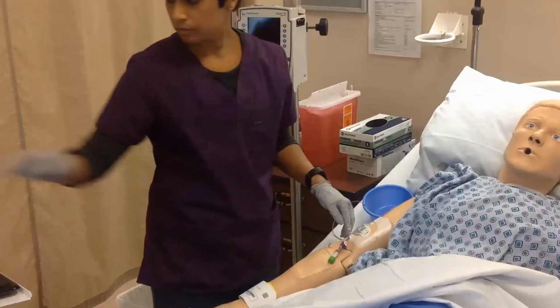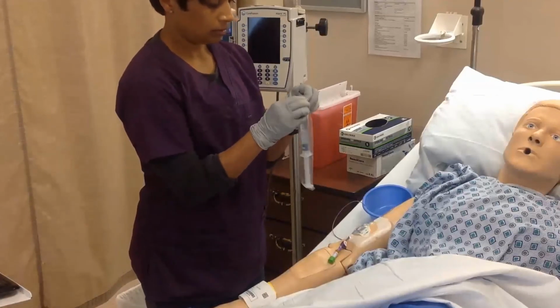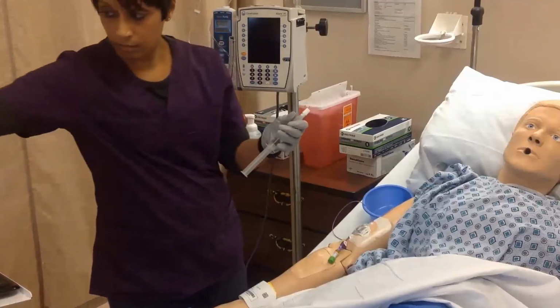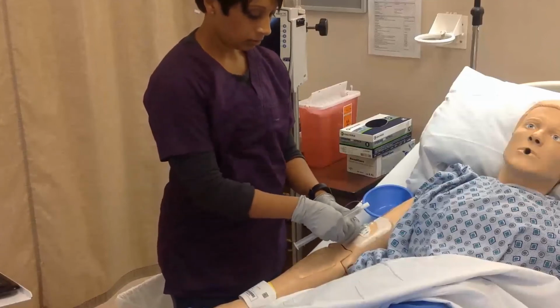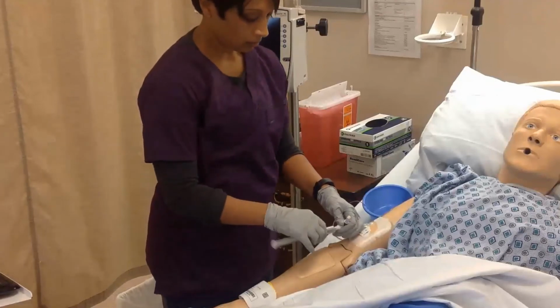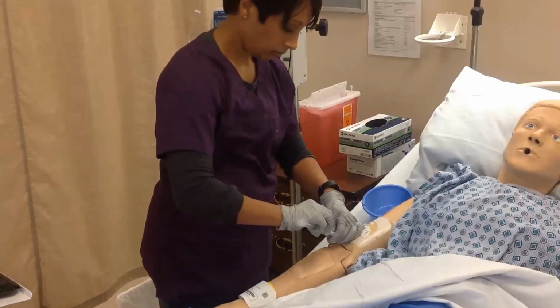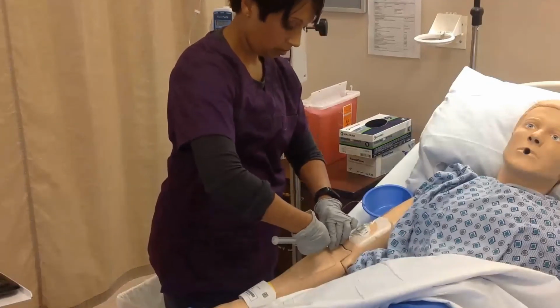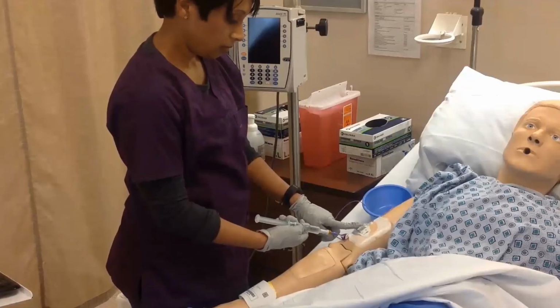Next, remove the normal saline flush from the packaging and hold in your hand. Vigorously wipe the end of the PICC line port you are about to access with an alcohol wipe for 15 seconds and allow to dry. If there is a green Curos cap on the port, remove and discard. The port does not need to be wiped again with alcohol. Be careful not to contaminate the cleansed port by touching it or dropping it back onto the patient's skin. If this does occur, repeat the cleansing process.